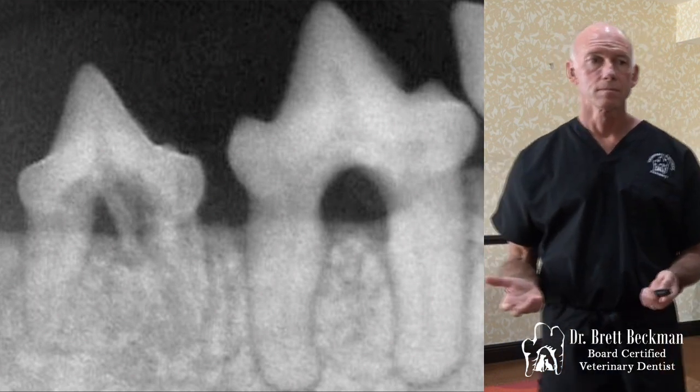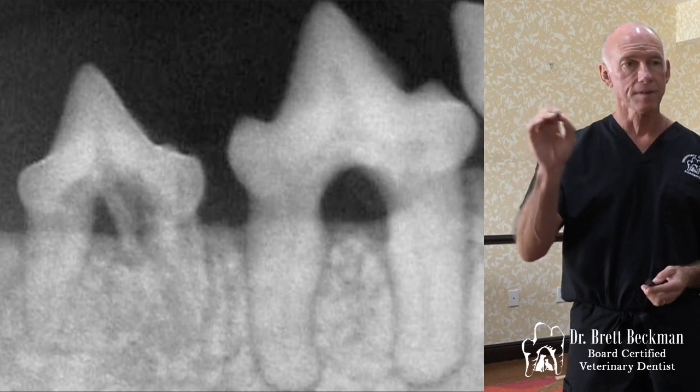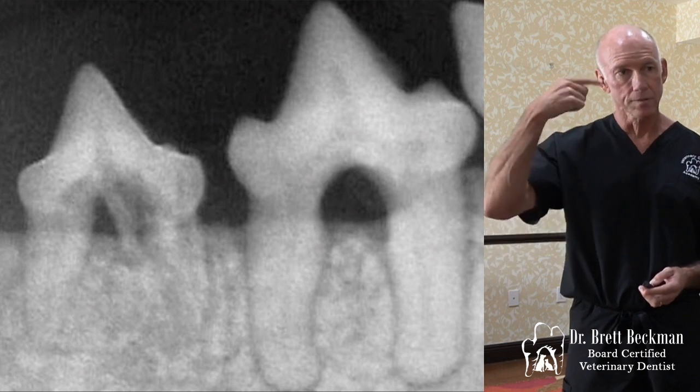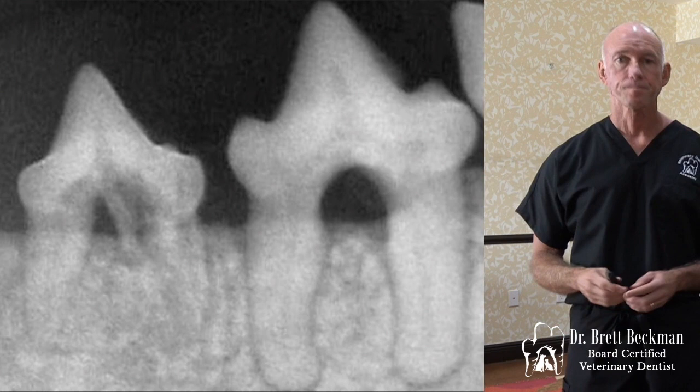So fracture supersedes anything. Before you even take an x-ray, if you've got pulp exposure, that is an extraction or a root canal. That's what you're thinking. And then you look at the x-ray and make that determination.